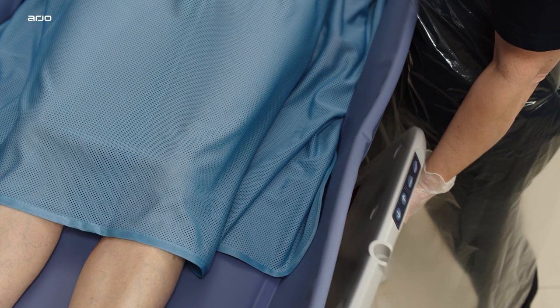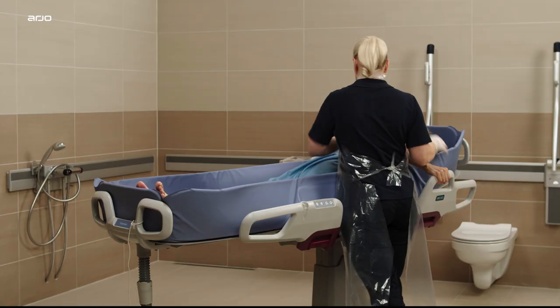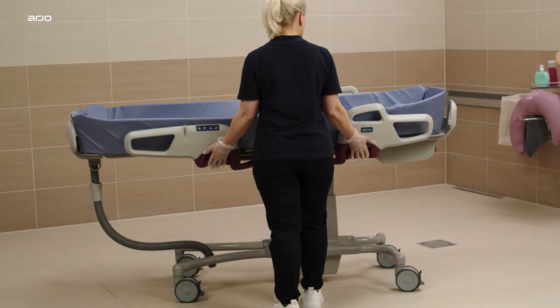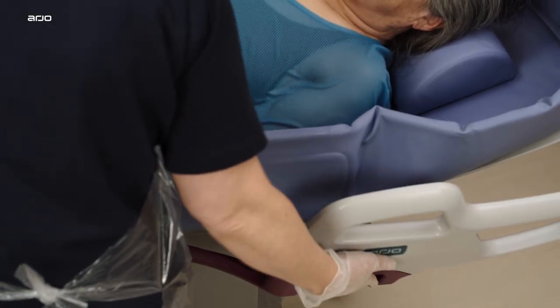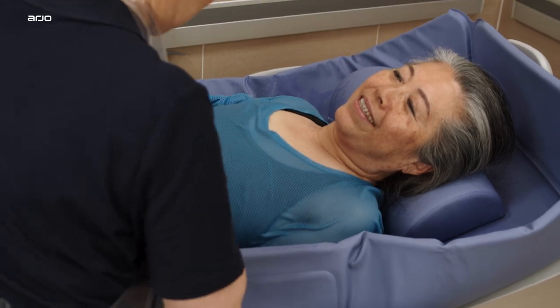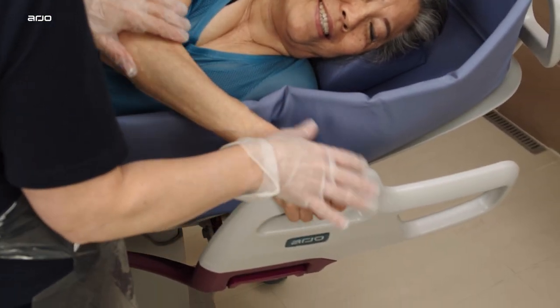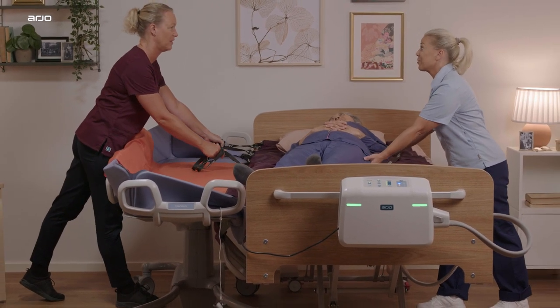The side supports provide security for the patient whilst positioned in Corivo. The side supports have three different positions: inner position, outer position, and down folded position. The outer position allows more space in the trolley, for example for rolling of the resident or patient. The down folded position enables lateral transfers from the bed to the trolley.